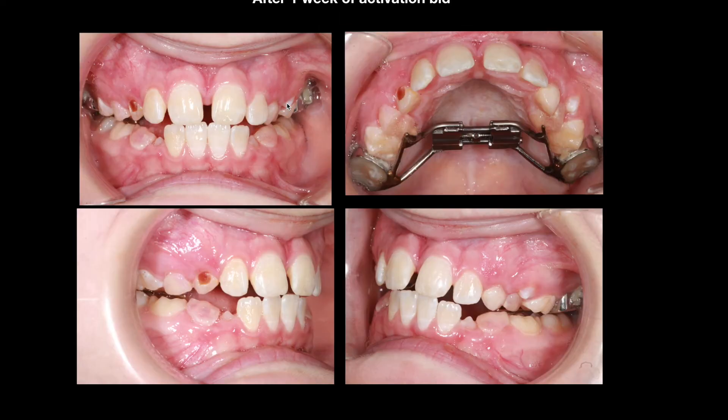I bring in the patient after one week of activation, so we anticipate having at least 14 to 16 turns by then. This is the amount of space opening in between the central incisors — as you can see, it's almost two to two and a half millimeters.